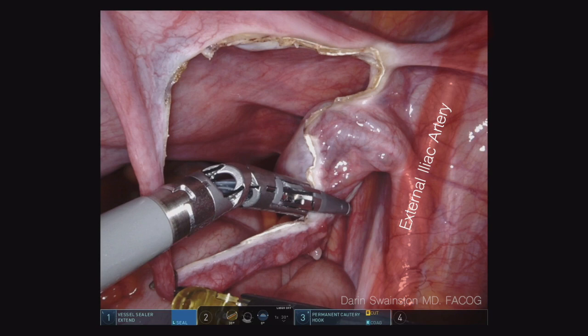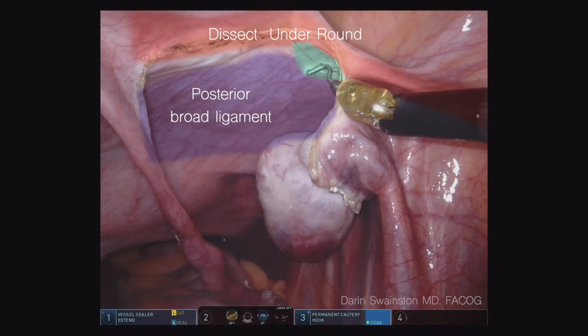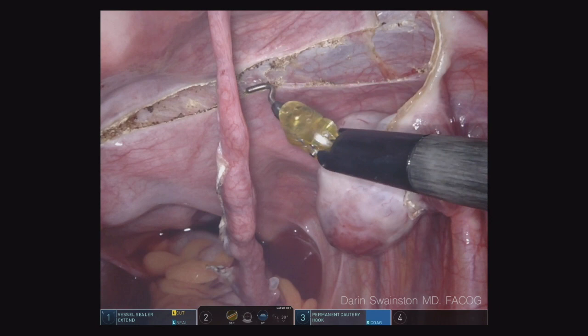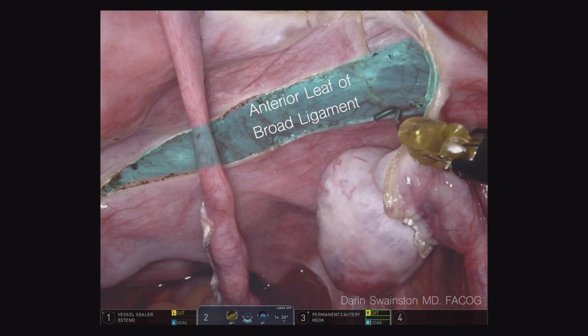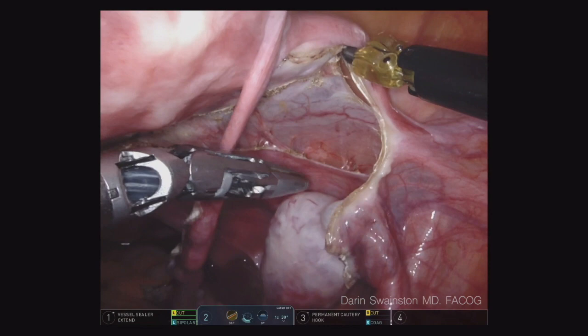Notice how I do this portion last — that way I can keep that traction. I'm going to be in the outer one-third of the round ligament. You can see that little tiny incision on the back of the broad ligament that was created by hugging up against the round ligament. I'm going to use the back of my hook to make this dissection occur. Now you can see the anterior leaf — I make a little incision and that allows me to do that upward and medial traction with my hook, which allows me to dissect out that broad ligament, reducing the chance of getting the ureter.